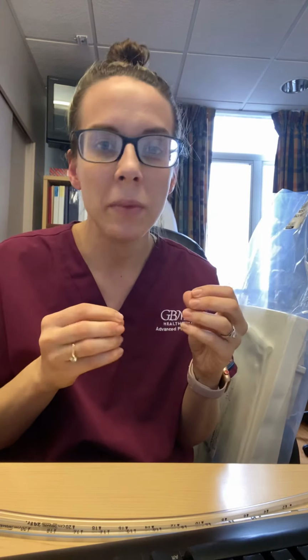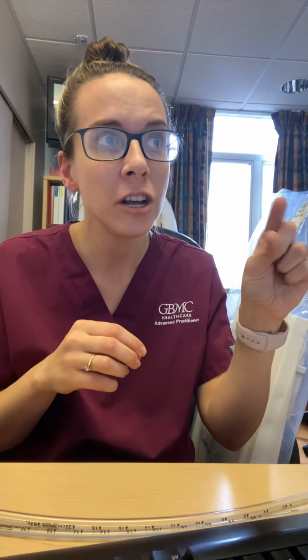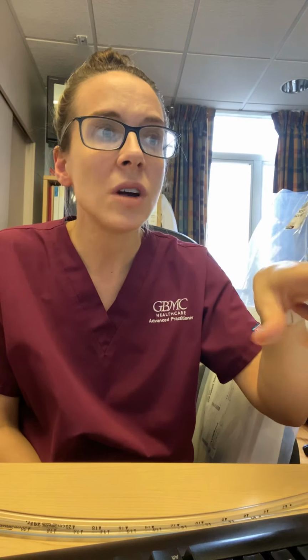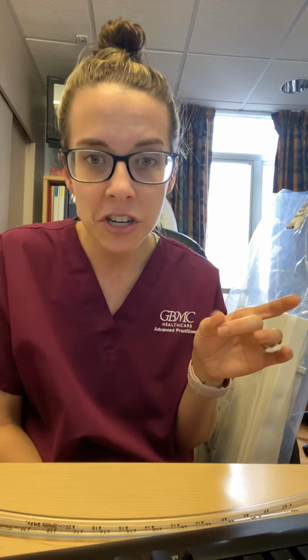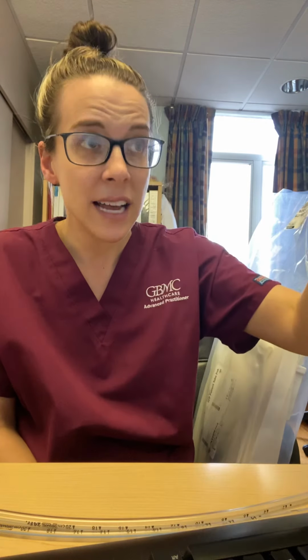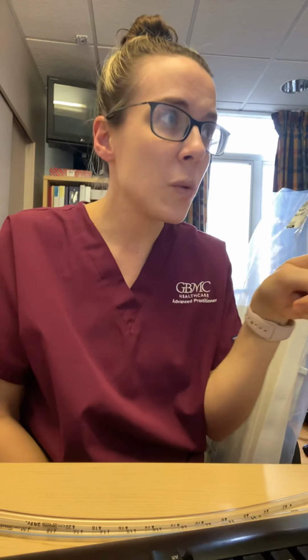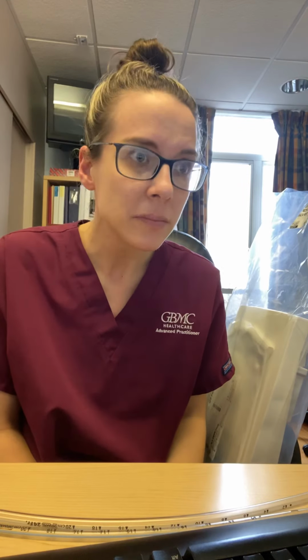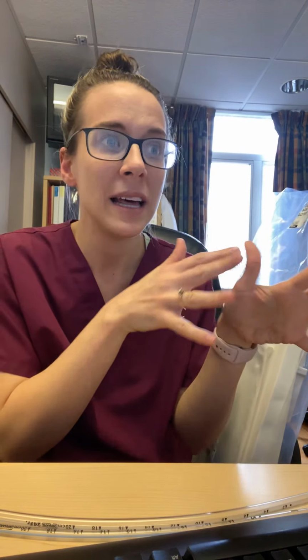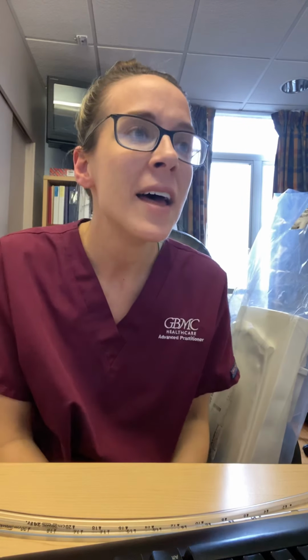So the dry suction method, the one on the right, it's all controlled by a built-in regulator. That suction control dial that I have circled in red, that is where you control the suction. The pros are it's quiet, there's no evaporation to worry about. If you knock it over, no big deal, nothing's going to matter. There's a wider range of suction that you can adjust on the dry suction, -10, -20, -30, -40, whereas the other one only goes up to, it looks like, -20. Again, I don't really know for sure because I never really used it, but the manufacturer told me that there's a wider range of options on the other one, so I'm going with it.